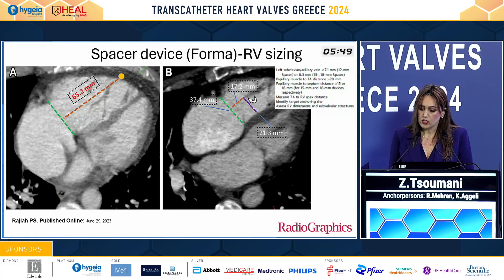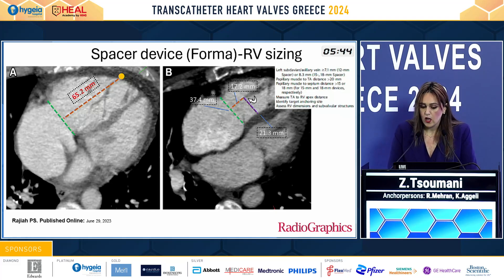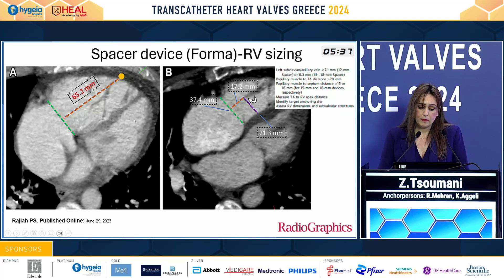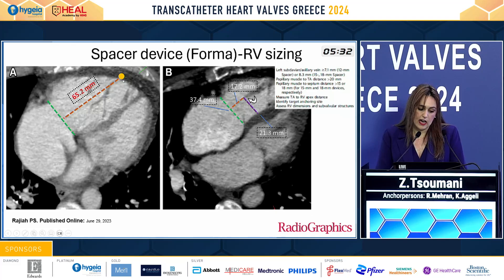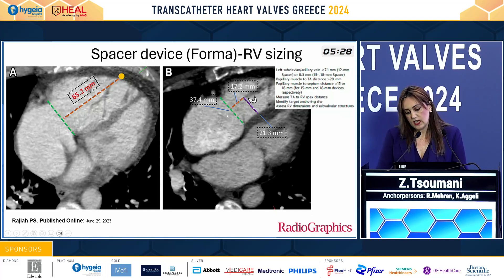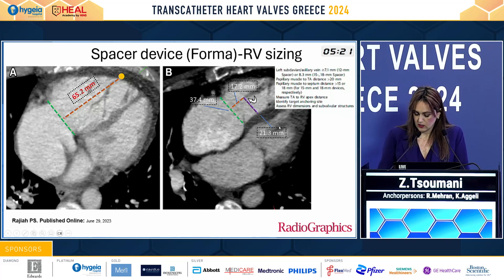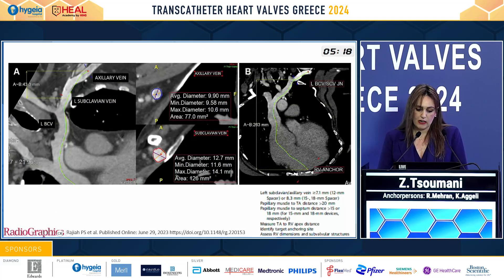Another example is when we use a spacer device — for instance, FORMA — where we must measure the RV size perpendicular to the tricuspid valve, up to the RV insertion point of the device, the height and width of the anterior papillary muscle, as well as the diameters of the left subclavian vein and the left axillary vein.